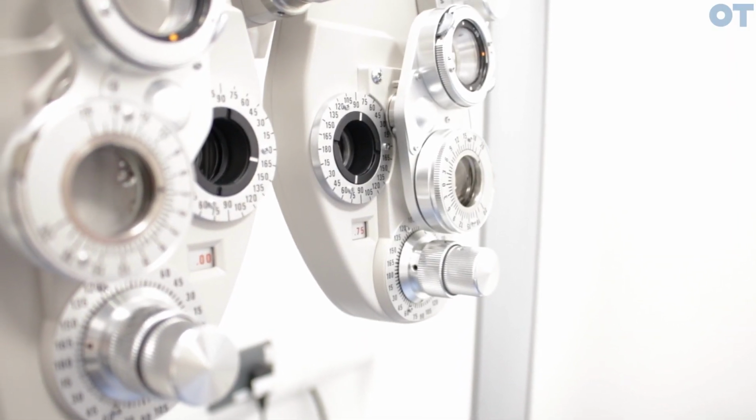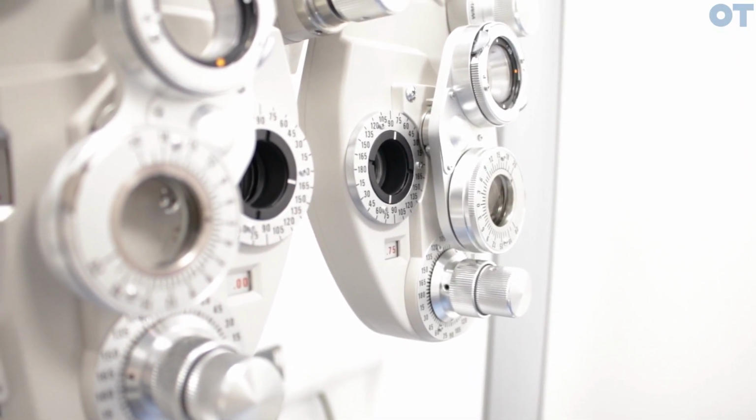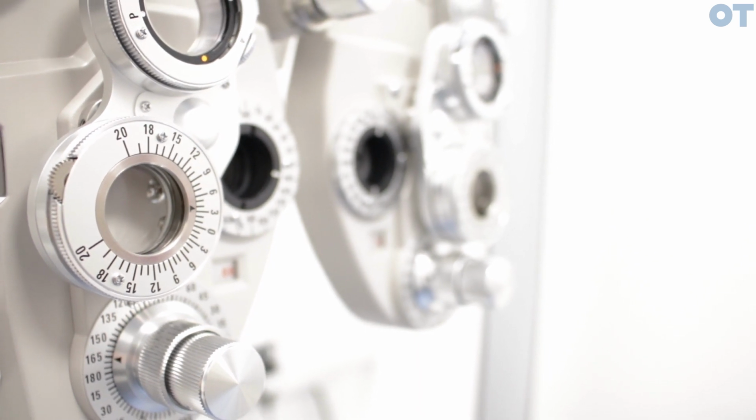They have the trial lens case as you would expect in a standard practice. Those bays that are dedicated towards contact lenses will have either a keratometer or corneal topographer within them, and those that are dedicated towards eye testing will have the phoropter set up as we have in this room. Pre-screening is undertaken by a student, and typical pre-screening will include peripheral vision testing, intraocular pressure testing and retinal imaging. The patient is then taken back to the waiting area and called through by a separate student for the main examination that they're doing.